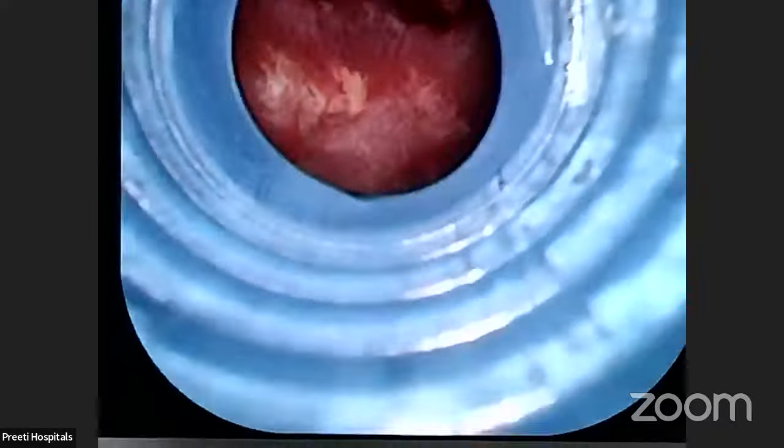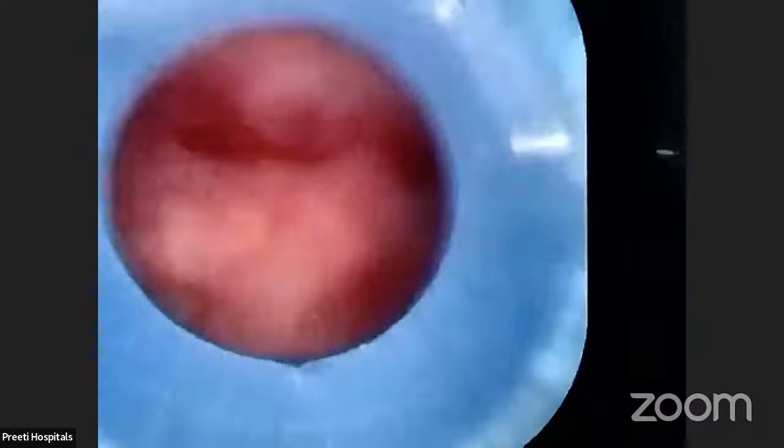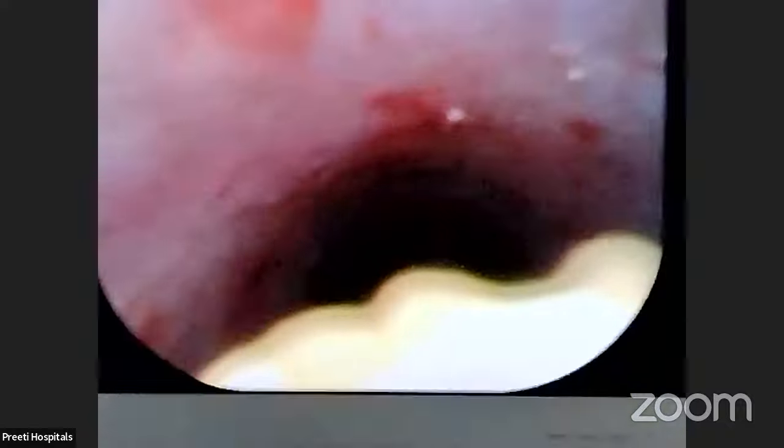What is he doing? He is an experienced person, my technician. Nobody can push that. Now flush. See, flush, yes. So that is the most dangerous thing. If you are going from one calyx to another calyx, you should flex, see here. Don't suck. Yeah, now let them come out. I will show how to travel between the calyces.